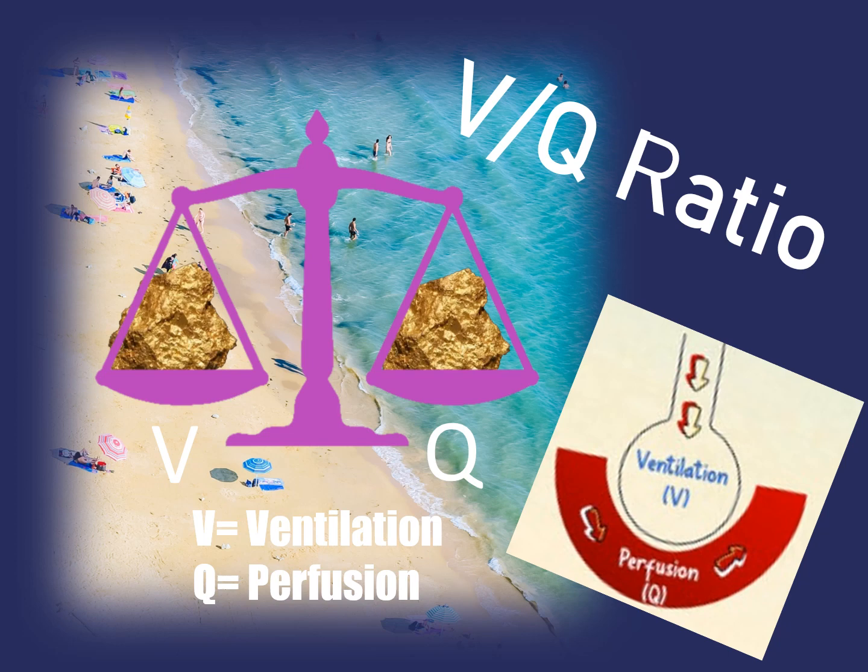When we apply the VQ ratio to capnography, the V stands for ventilation, and it is equal to the patient's respiratory status, and the Q, which is perfusion, represents circulatory, metabolic, or other pathologies that limit CO2 from reaching the alveolar membranes. When we have a normal VQ ratio, there is a normal respiration, and the end-tidal CO2 values are within normal ranges.